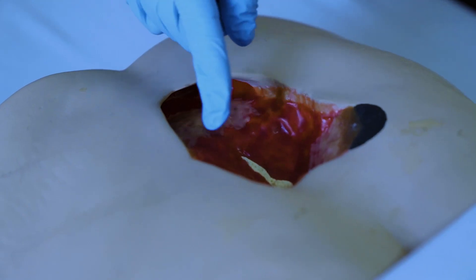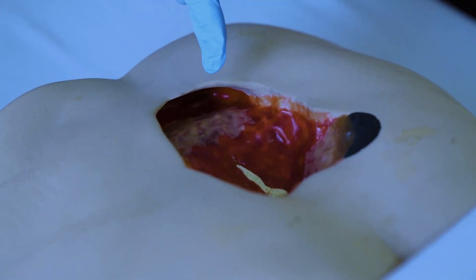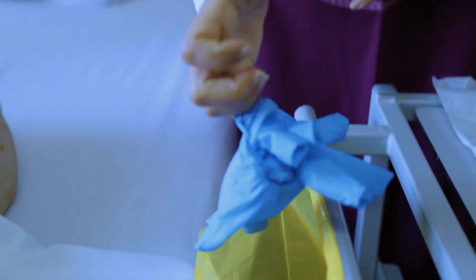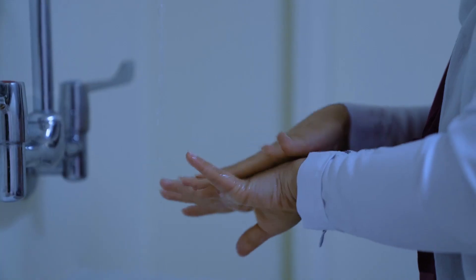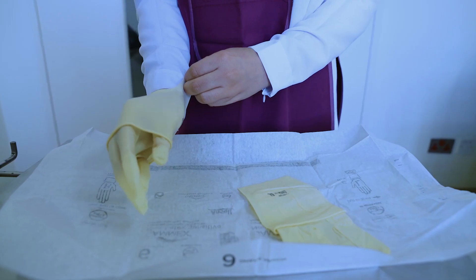Wear clean gloves to remove the old dressing. Assess the wound for appearance, drainage, and surrounding tissues. Discard the soiled dressing and gloves, then perform hand washing.